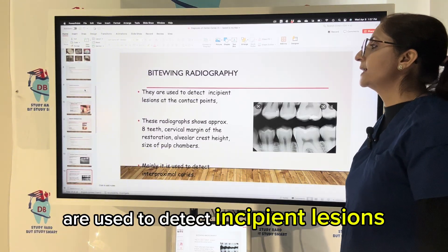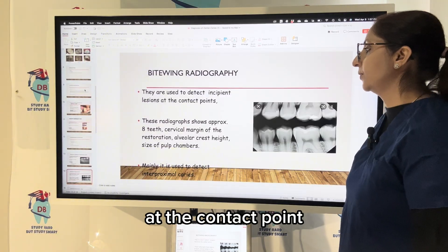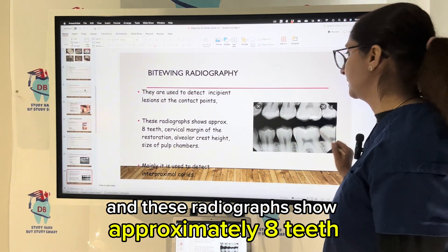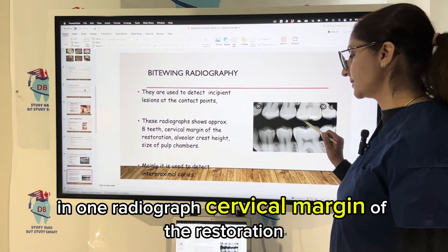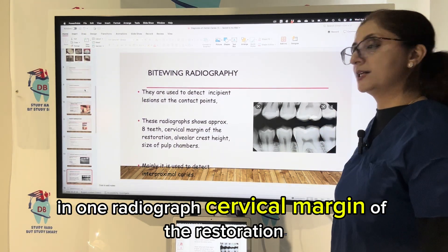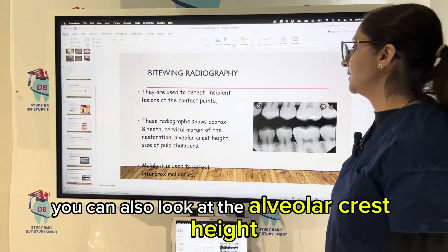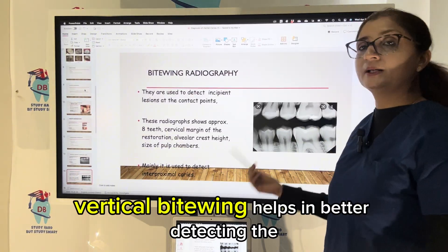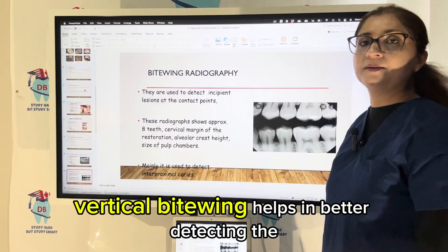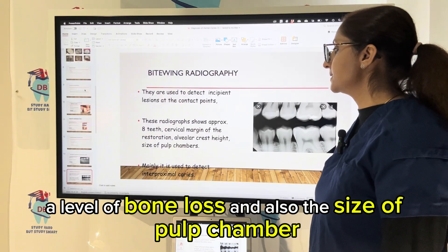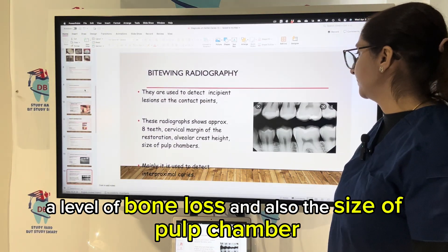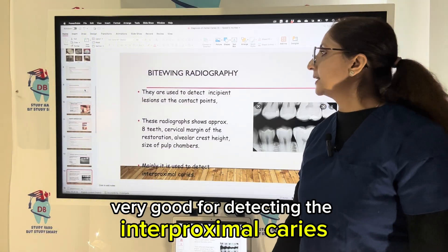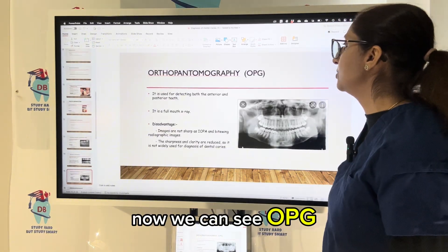Bite wings are used to detect incipient lesions at the contact point. These radiographs show approximately eight teeth in one radiograph and also reveal the cervical margin of restorations and alveolar crest height. Horizontal bite wings are standard, while vertical bite wings help better detect alveolar bone loss and pulp chamber size. Bite wings are definitely very good for detecting interproximal caries.